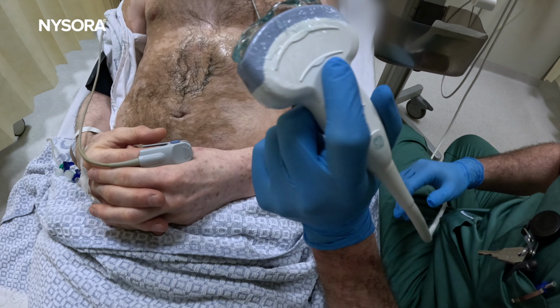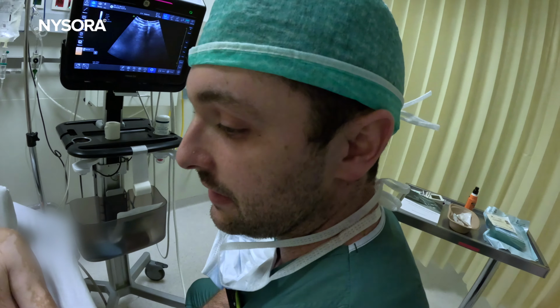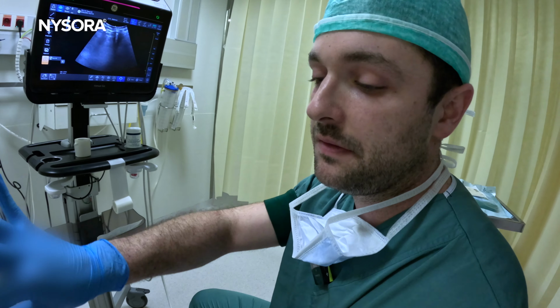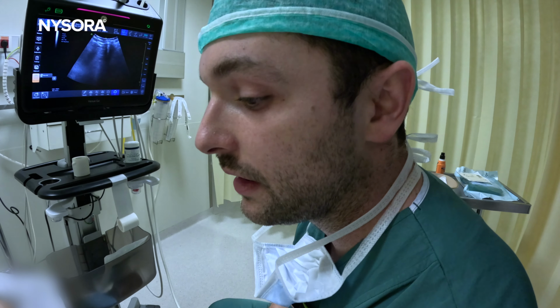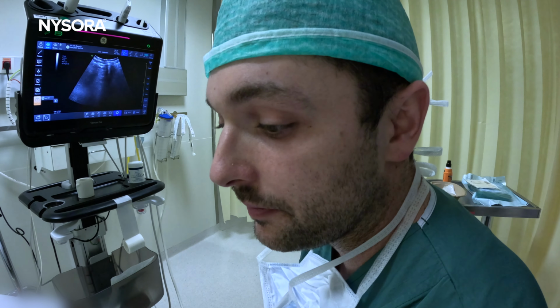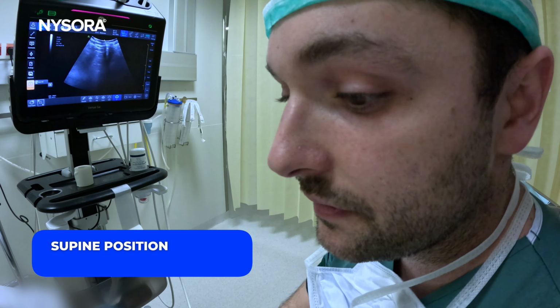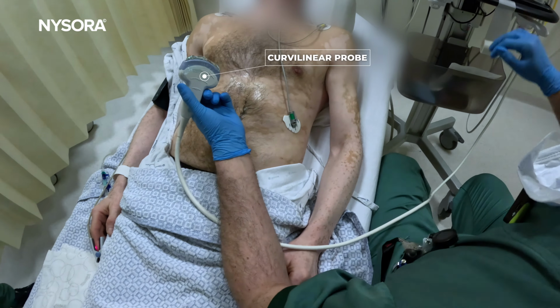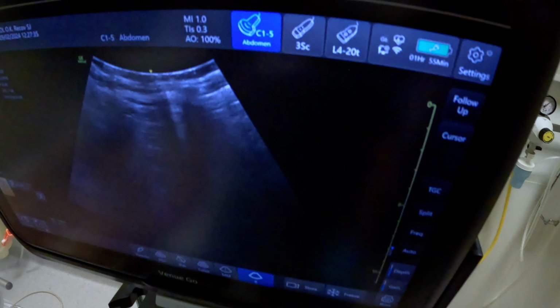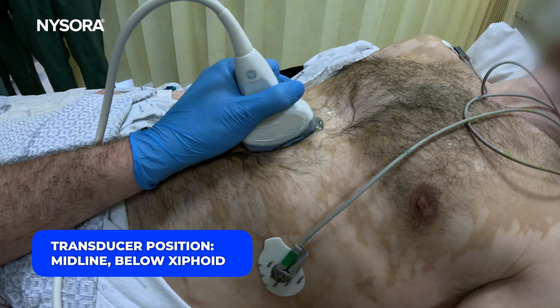So here we have a patient with type 1 diabetes and a confirmed diabetic gastroparesis, to see if we can safely administer perioperative sedation for the block. We're going to check if his stomach is empty. We're going to do this in supine position for starters. We use the curvilinear probe on abdominal settings, about 10 to 15 centimeters deep. Put the probe in the midline, just below the xiphoid.